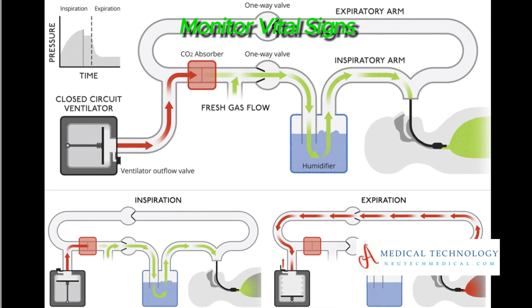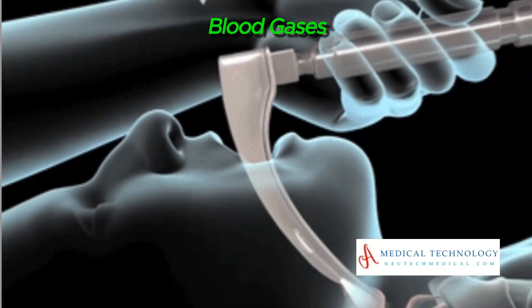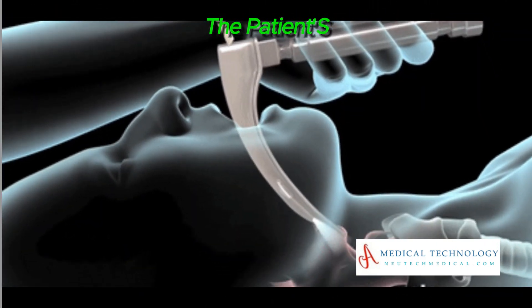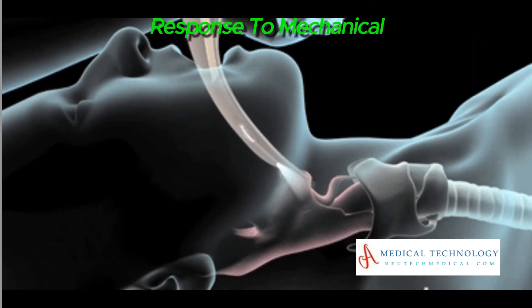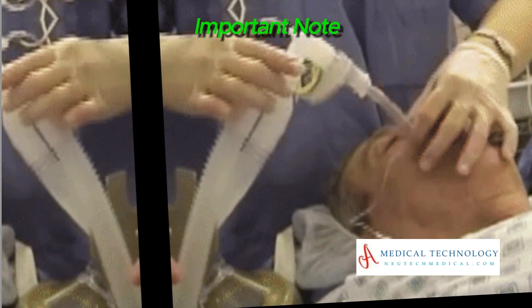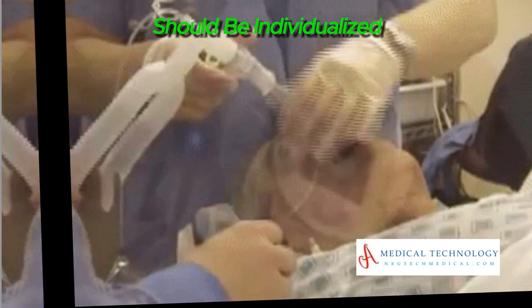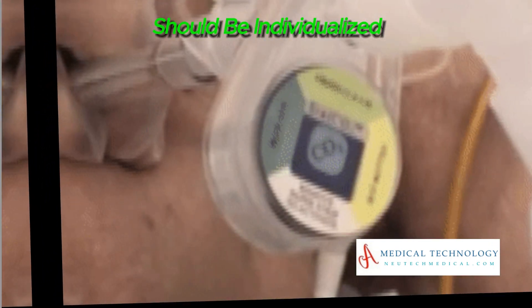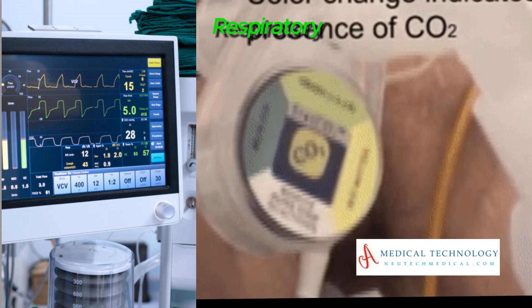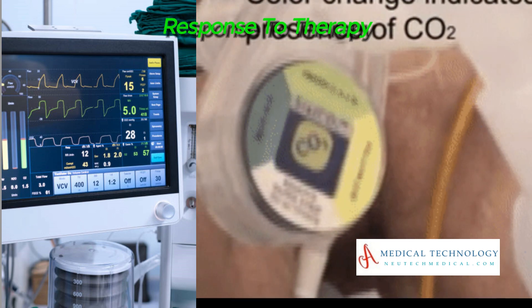Continuously monitor vital signs, blood gases, and other relevant parameters to assess the patient's response to mechanical ventilation. Ventilator settings should be individualized based on the patient's diagnosis, respiratory mechanics, and response to therapy.